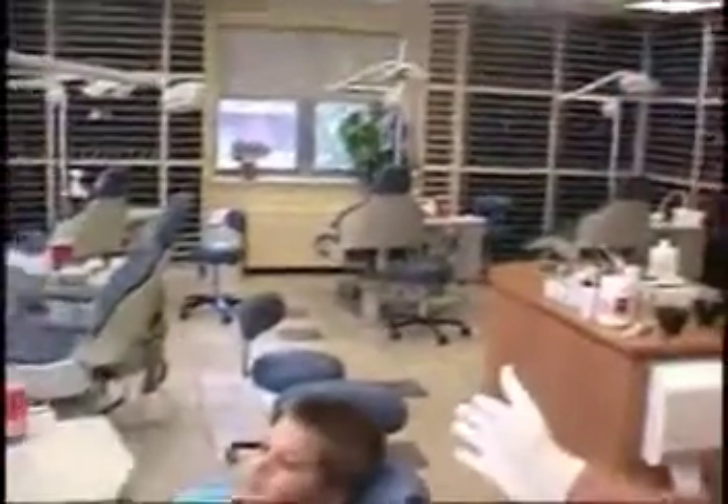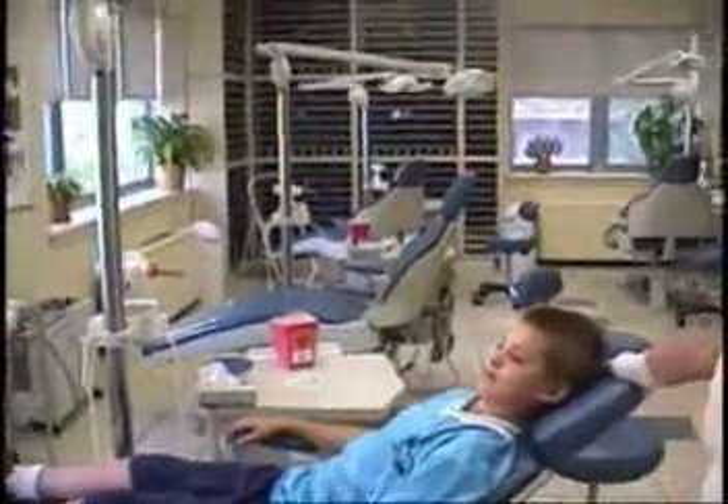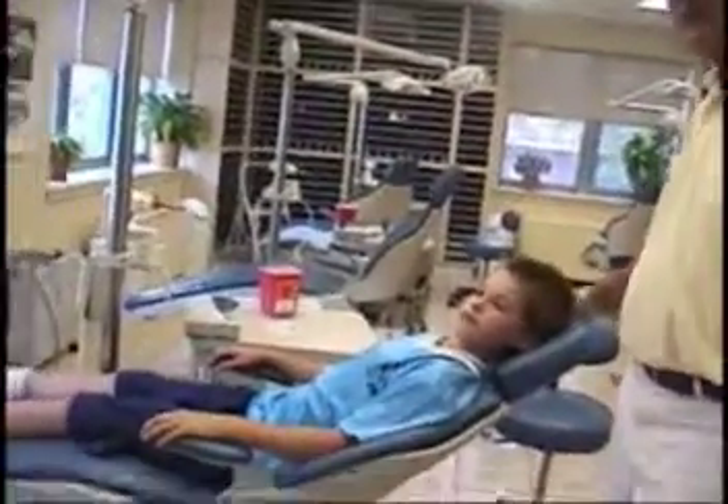Before we say something else, there is a certain position — if anybody's ever going to regurgitate, it is this position right here. If you take an impression of a young person in this position, if there's any tendency to gag, then that will be the position that they gag. In the office we call it BP, bar position.